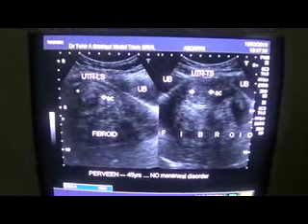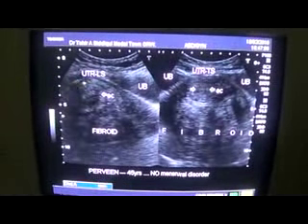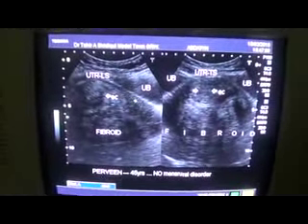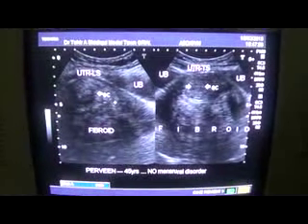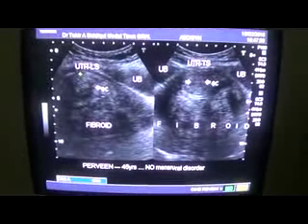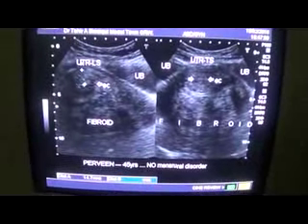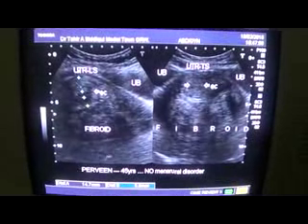Now, on the left side, this is the uterus in longitudinal section. As you see, this area is the cervix, this is the anterior myometrium, this is the posterior myometrium, and this is the endometrial canal, almost appearing central but is not central. As you see here, it measures approximately 14.7, and from here it measures only 9.5.